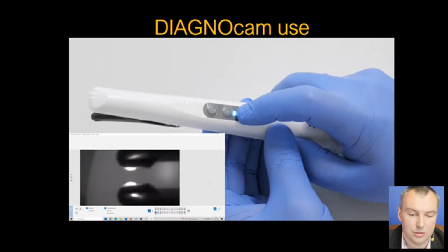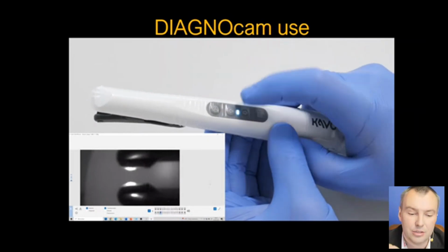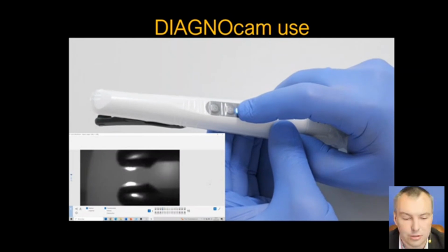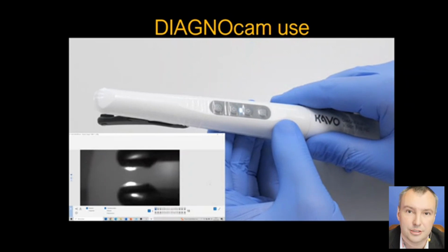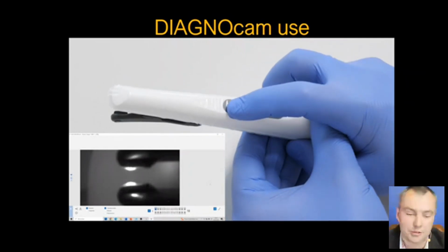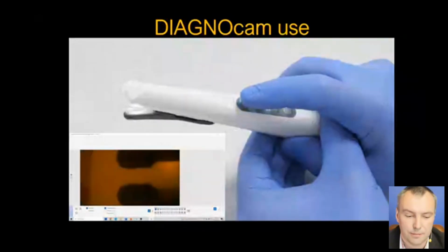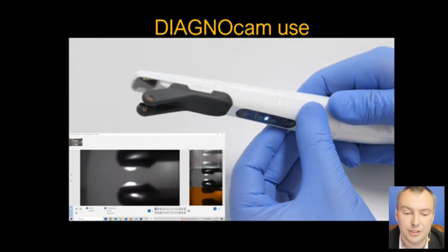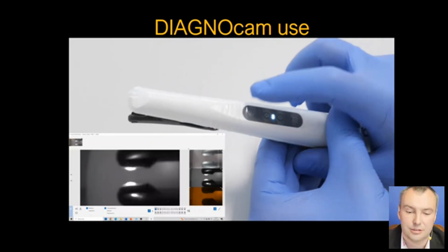It won't be visible. With those 2 arrows, you change the number of the tooth on the tooth diagram. So you can see how it is changed. Each press means one tooth change. And the button with the triangle is for taking images. We have a multi-shot mode. With transillumination, we get 3 different images.